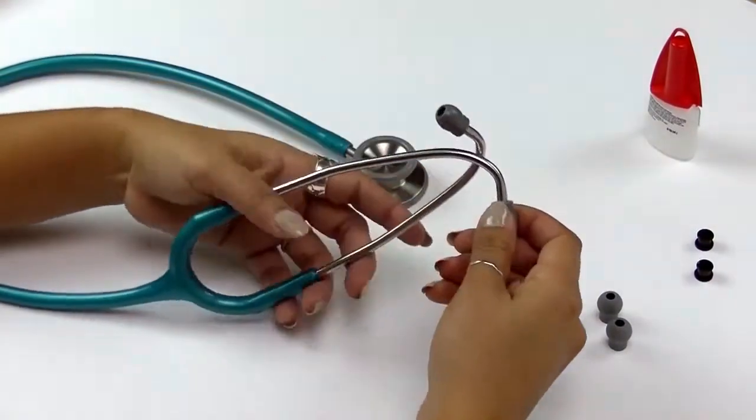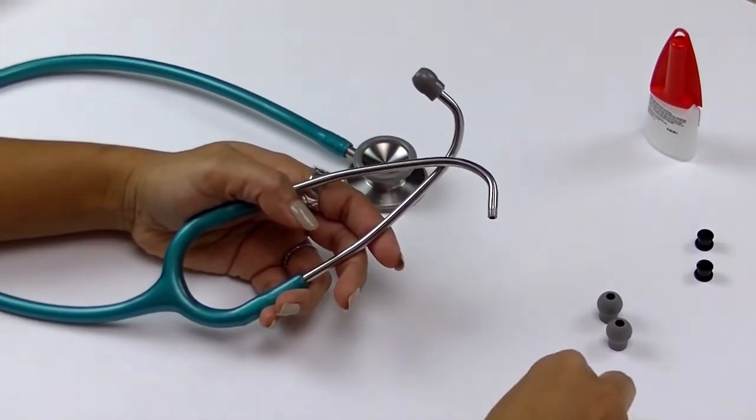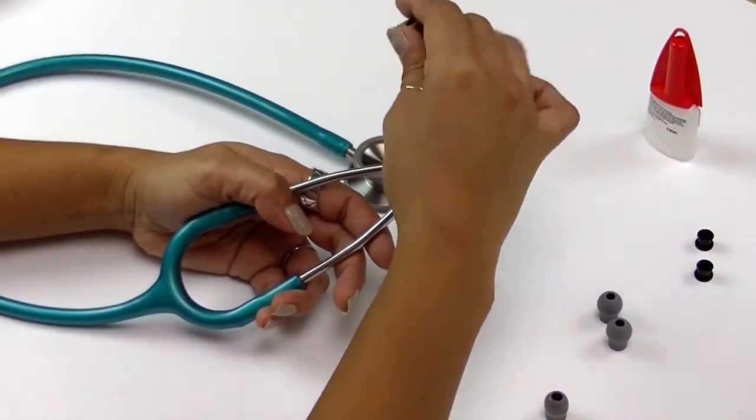First, you will need to remove the existing ear tips by unthreading them. Your new ear tip is attached to the binaural with the aid of an adapter. This adapter will be attached to the binaural.